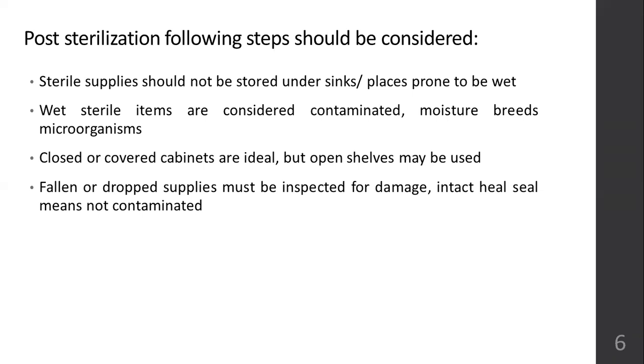And whether the intact seal is there or not, that has to be checked. So these are the post sterilization steps. Make sure that you don't keep it near a wet, moist place. Okay. It should not fall.